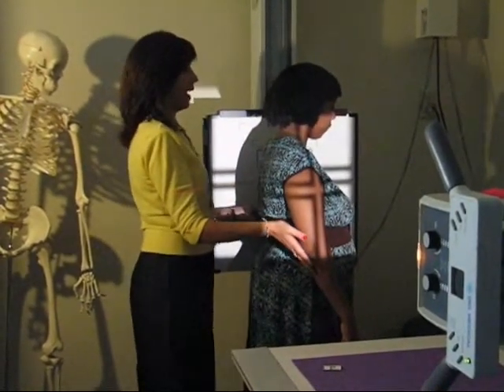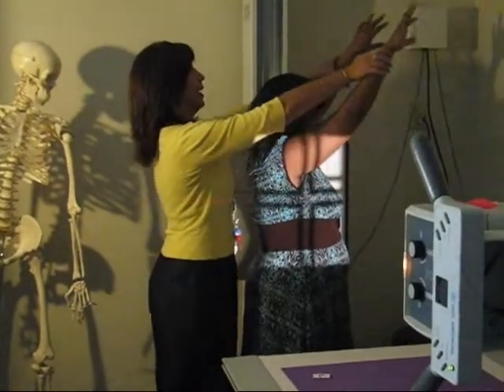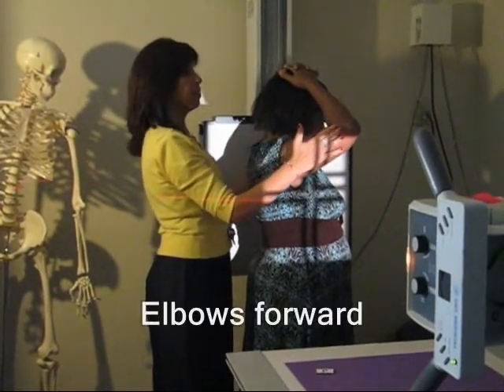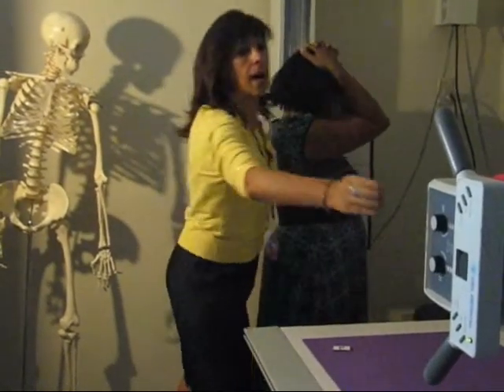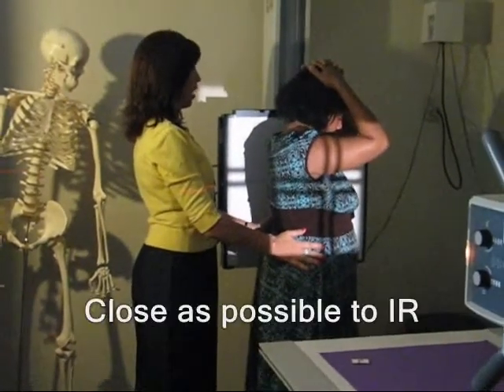We're going to ask our patient to bring their hands up. They can, if they want, rest their hands on their head. Remember to ask them to bring their elbows forward so that it doesn't create a space between the patient and the IR.